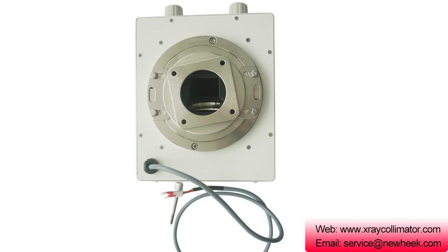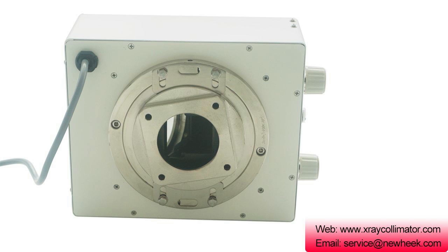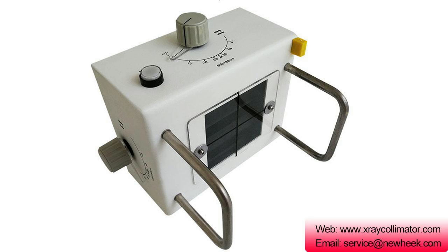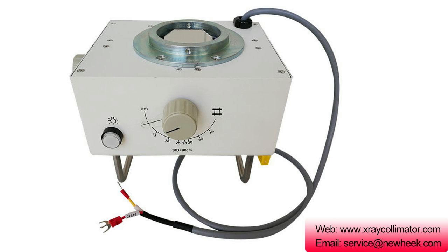The main difference is that NK-102 is suitable for a 125 kV X-ray tube and fixed X-ray machine. NK-103 is mainly suitable for a 125 kV X-ray tube and portable X-ray machine. NK-202 is mainly suitable for a 150 kV X-ray tube and fixed X-ray machine.